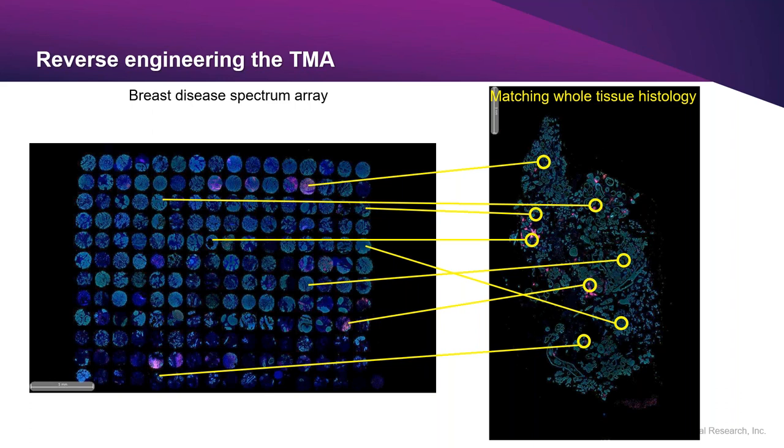Since TMA cores are typically focused on a specific and relevant region of interest, we expect we'll need fewer cores to represent the TME 8-plex assay than random field generation. Another possibility is to have a pathologist define fixed regions at a known tissue coverage to be more in line with the TMA cores.